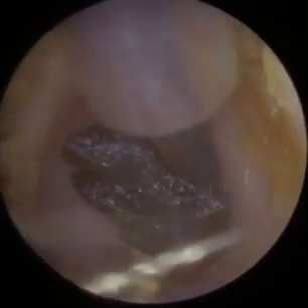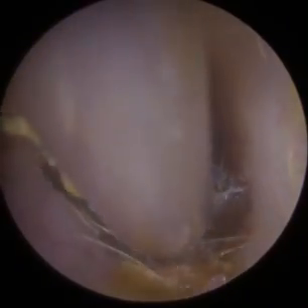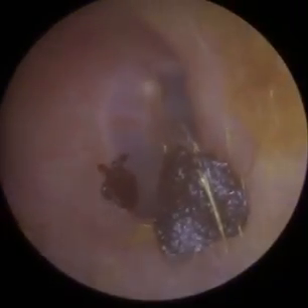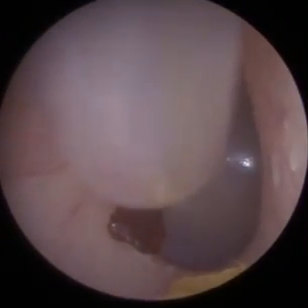So let's go. Let's just get attached to it, but just loosen it up a bit. It's a little bit flat. It's a little bit noisy now because the ear canal is clear. Let's just get as flat to it as I can.